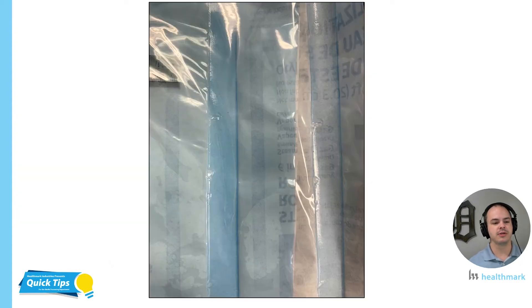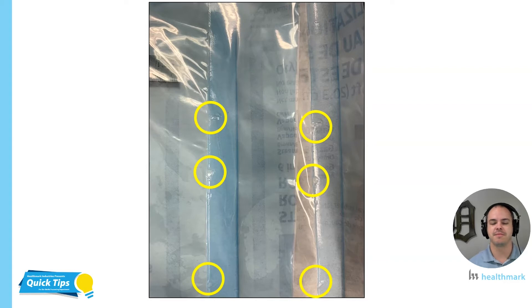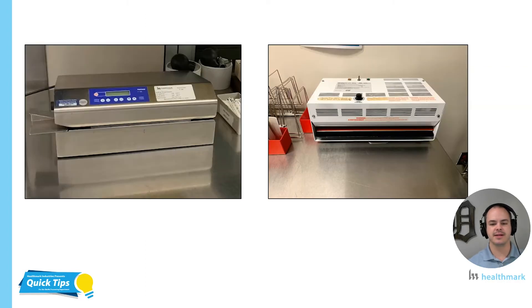I just want to show you another example real quick. Hopefully now that we looked at the other one, the defects are kind of jumping out at you as we look at this picture. I saw three defects — there might even be more, but three jumped out at me right away. And of course, this is a double peel pouch item, so we saw those defects repeat themselves on the second pouch. We have a problem that's reproducing itself and it will probably continue to get worse if we don't do something about it. Before we get to taking action, we want to understand some basic things about the heat sealers themselves.